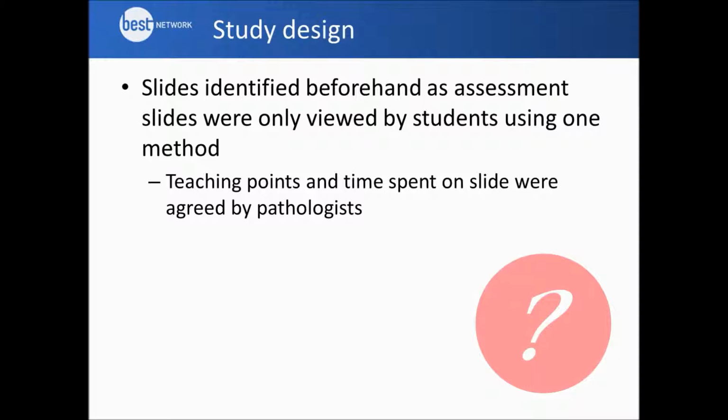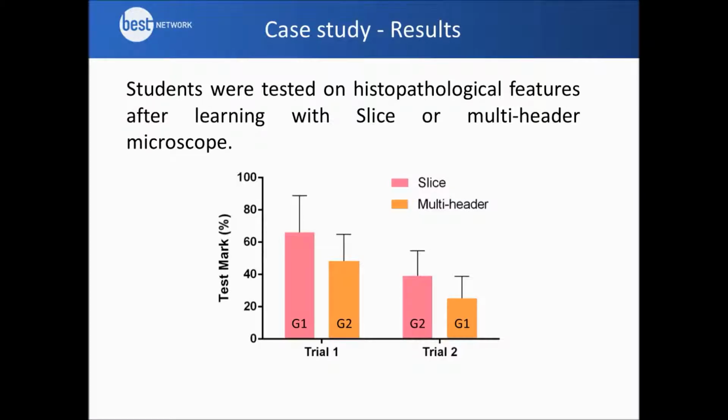Any teaching points and time spent on the slide were agreed by pathologists beforehand. After the exercise, students were tested on histopathological features after learning with SLICE or the multi-header microscope. Results showed that students that participated in the SLICE session performed slightly better than those that had participated in the multi-header session, and this was the case for both the first and second assessment items. However, it's worth pointing out that these results were not significant, though we note there was a very small number of students who participated in this study.